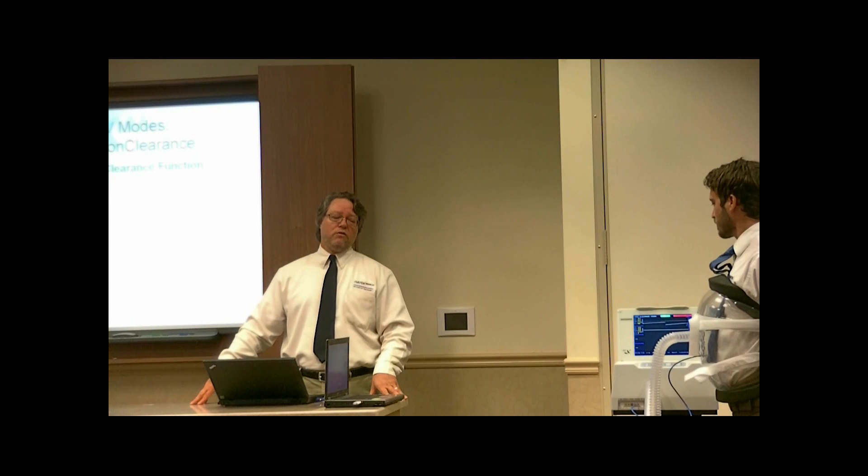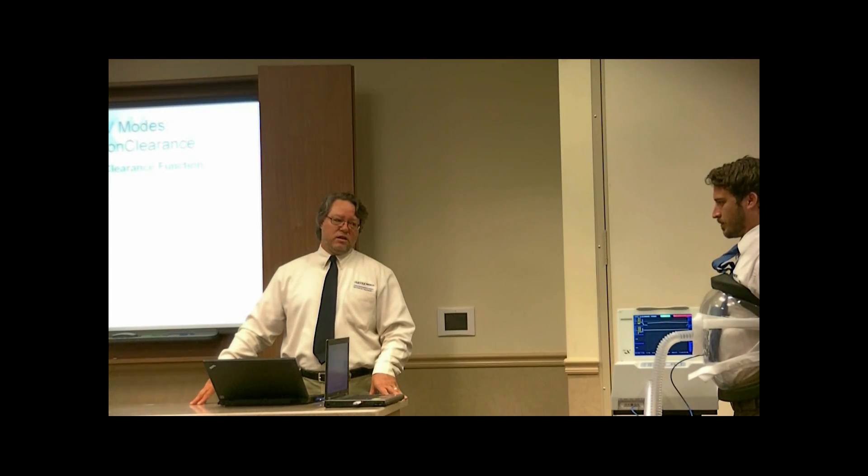So now it's going to switch over to cough assist. It's inflating his lung right now.